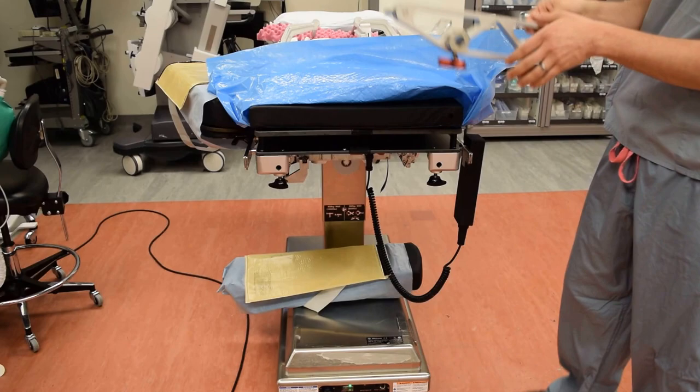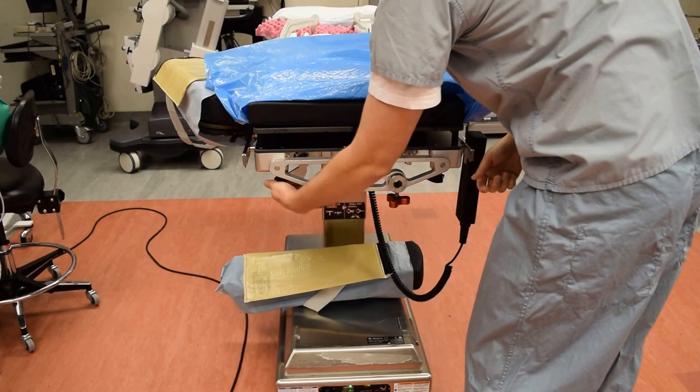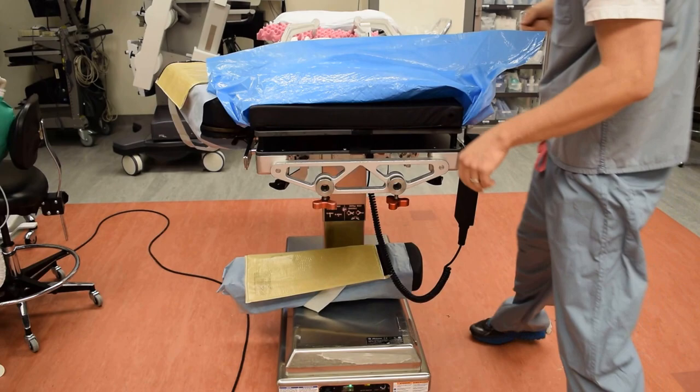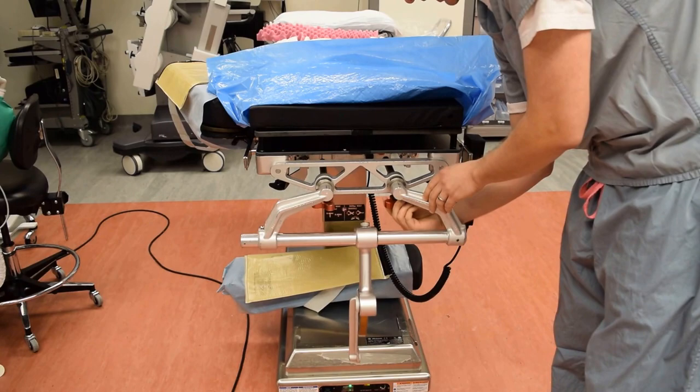The next step is we're going to put in the bed adapter and lock that in place. Sometimes you can have the bed adapter and the next part of the Mayfield already attached together to save time, but I just want to illustrate there are two pieces. After that, we'll place the positioning device all the way in and lock that in place.